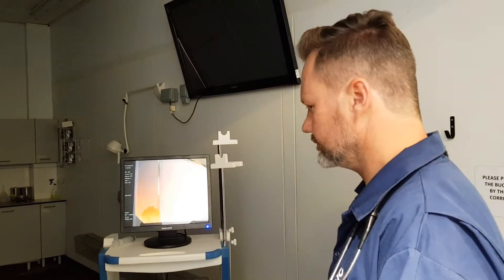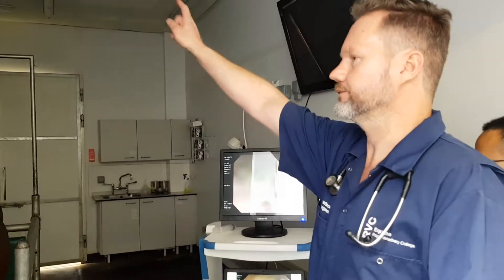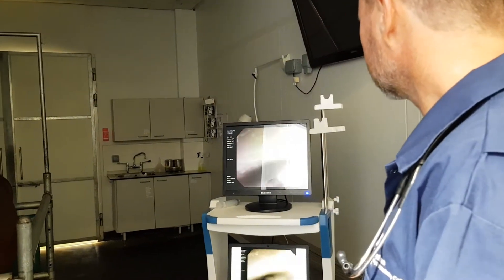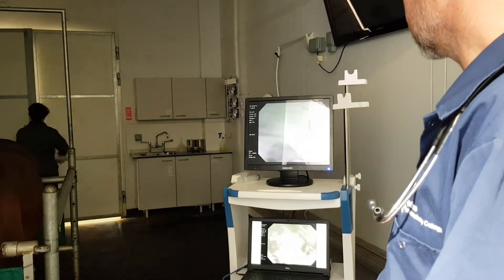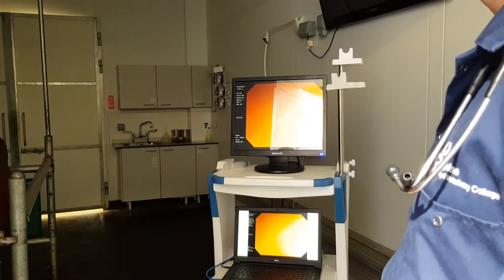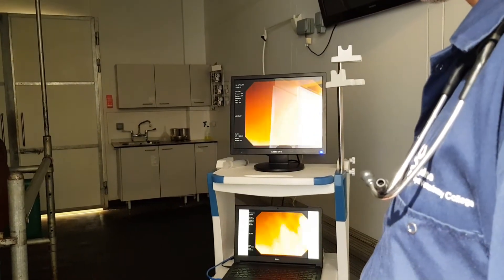Keep on going. Do you want to then quickly call the owner for us? She's just in the reception. Thanks. She asked me to find the eye pump. I didn't know that I found it.